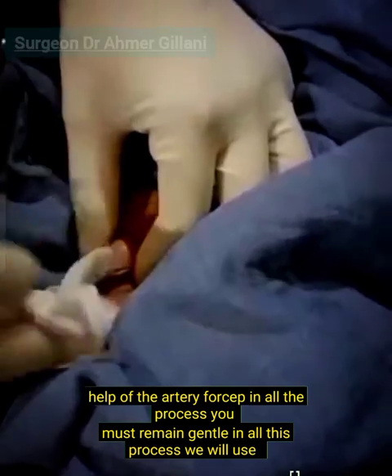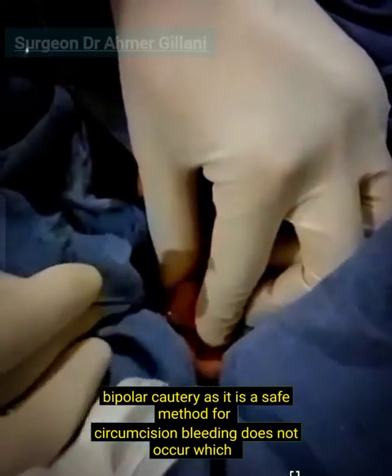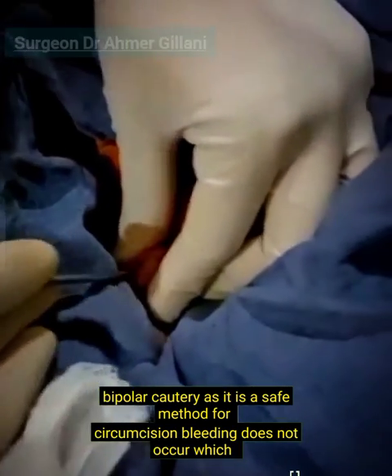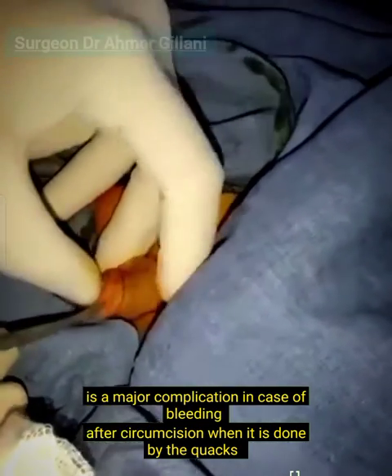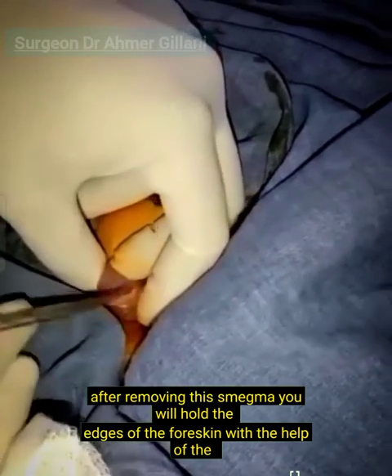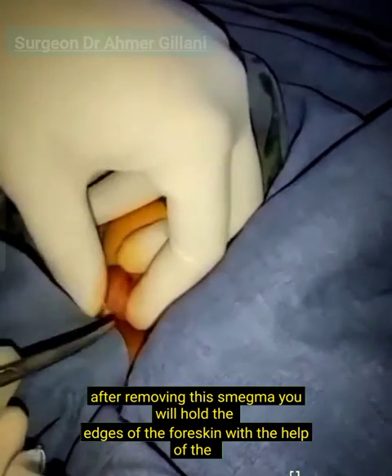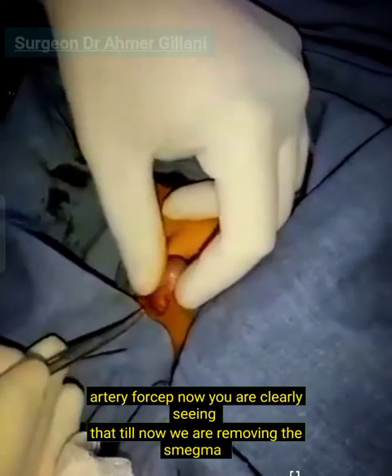In this process we will use bipolar cautery as it is a safe method for circumcision — bleeding does not occur, which is a major complication when circumcision is done by quacks. After removing the smegma, you will hold the edges of the foreskin with the help of the artery forcep.